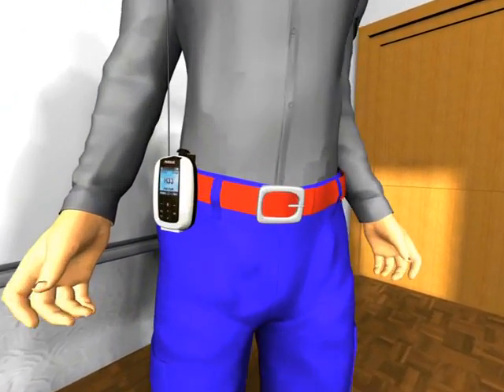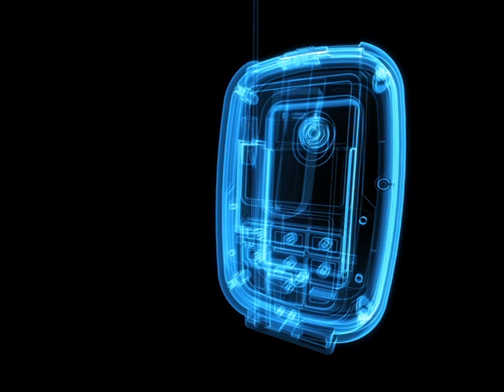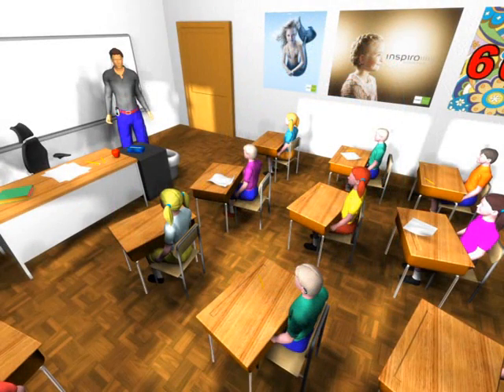Ambient noise levels in the classroom are constantly measured by the Inspiro transmitter. This is done in the short and longer speech pauses when the teacher is not talking. The noise is usually spread out evenly across a room. If the noise level is louder than 57 decibels, the Dynamic Speech Extractor starts to work. A command is sent from the Inspiro transmitter to the Dynamic FM receivers to increase the gain.